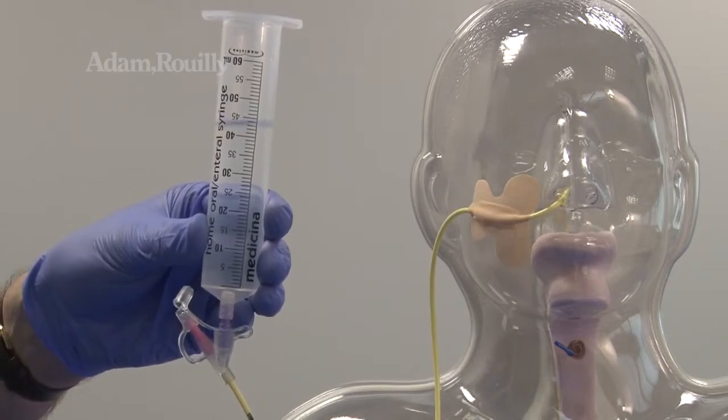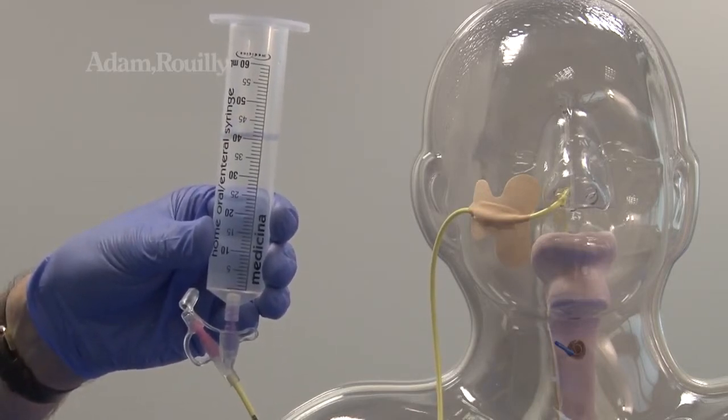Administering of liquid, feed or medication via bolus or pump can be simulated.